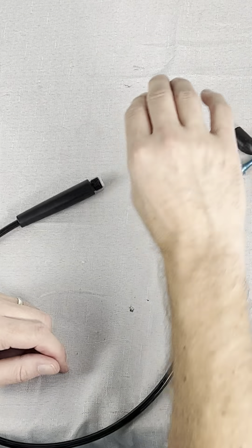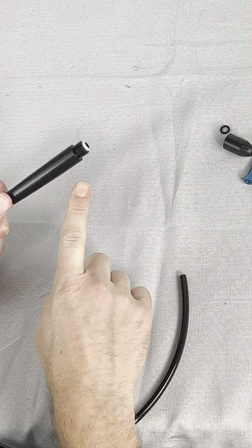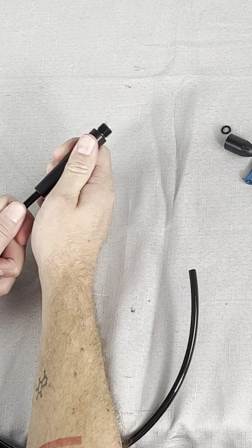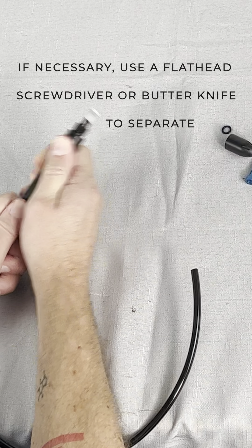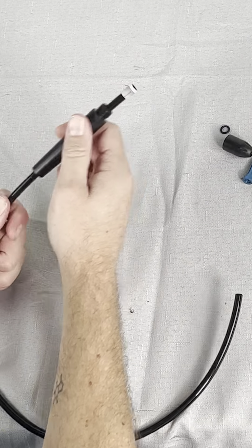If you're replacing tubing, there's a little more work, but just a little. To start, make sure the nozzle cap is removed. Then hold onto the handle and push towards it with the tube and the insert should come out.